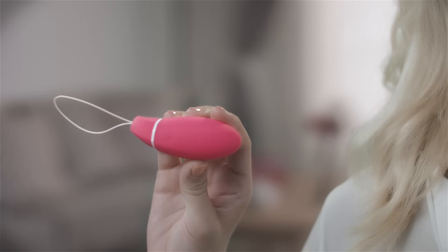Kegel Smart by Intimina is a personal trainer that helps you strengthen your pelvic floor muscles, and it's so easy to use. All you have to do is follow the vibration guidance, contracting when it vibrates and resting when it stops.